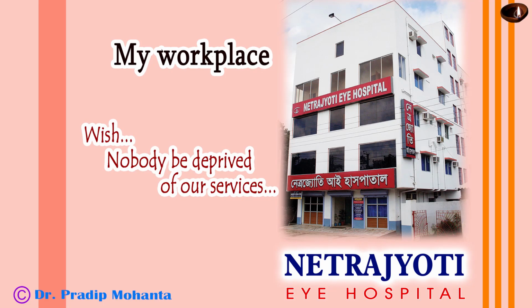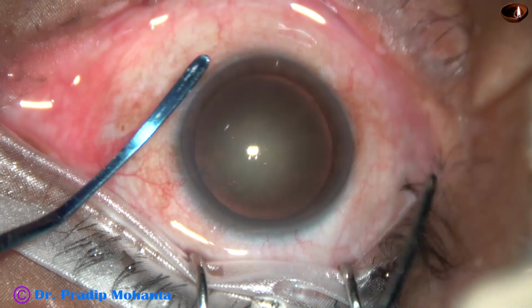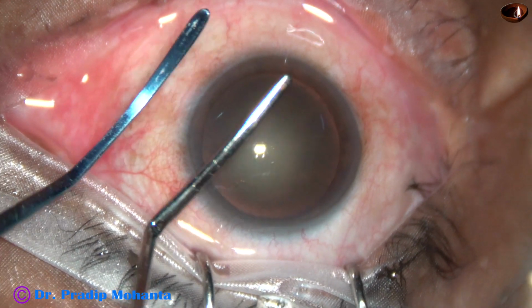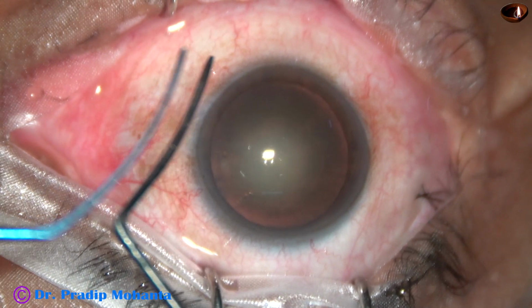Friends, in this video I am going to show some instruments that are developed from my ideas. This is the posterior capsular protector on my left hand. On my right hand is an iris spatula.